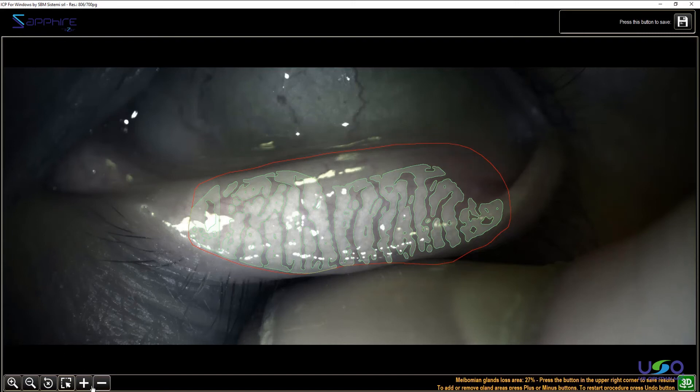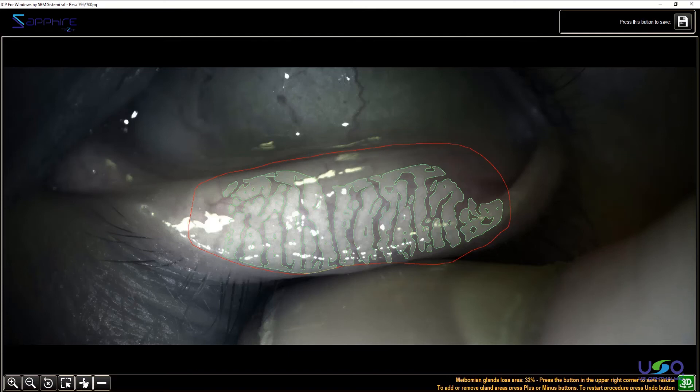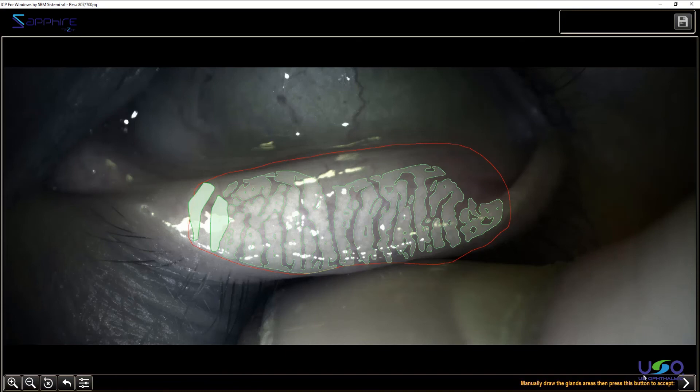You'll find plus and minus buttons on the bottom left. If you push minus, you can say that in your opinion this is not a gland, and you can remove it — and you'll see the value rises to 32%. Or you can push plus and say, no, this was a gland, it was my mistake. Once you're satisfied, go to next to accept it. Now we have 26% of loss.